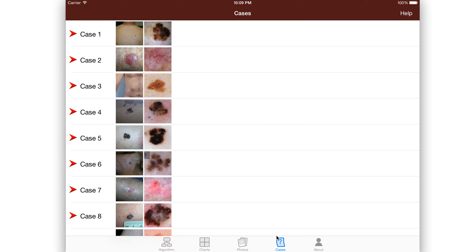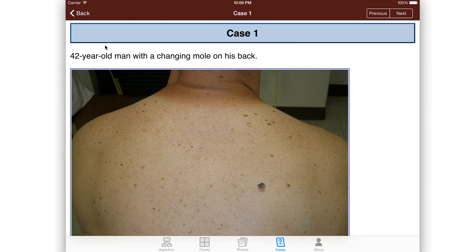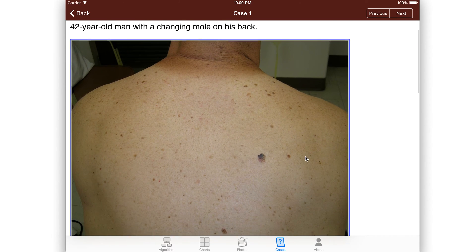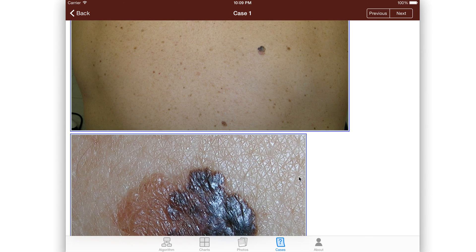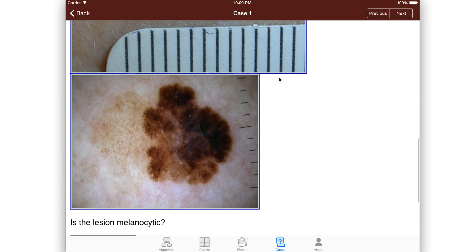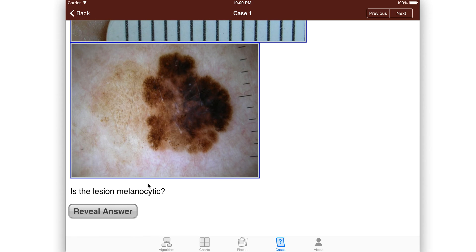For learning, the cases are fabulous. So let's say we do case one. It starts off showing us a picture of a man's back with a changing mole. We get the close-up of the mole, and then we see the dermoscopy picture. Based on this dermoscopy picture, we have to decide: is this melanocytic? If you see the negative network here, and the other network here, or some of the streaks out here, your answer would be yes, it's melanocytic.